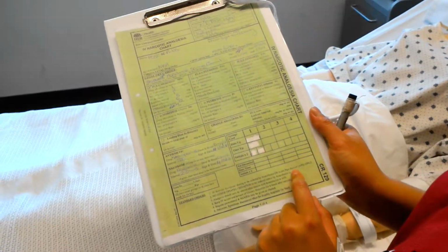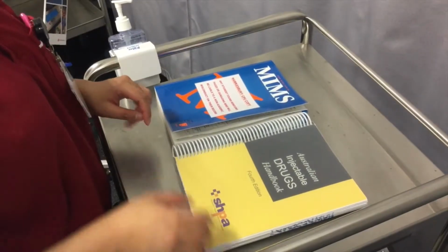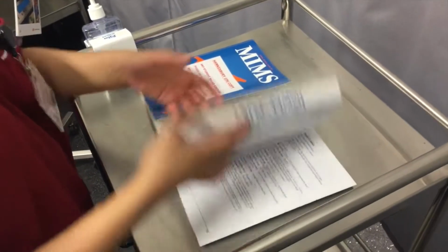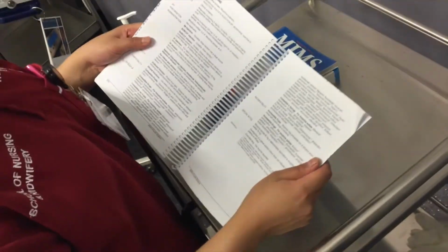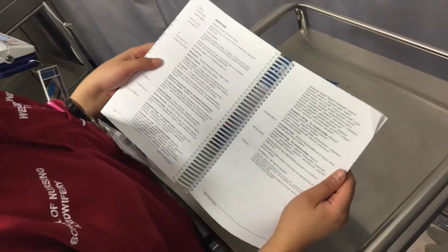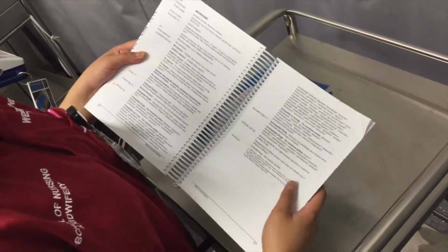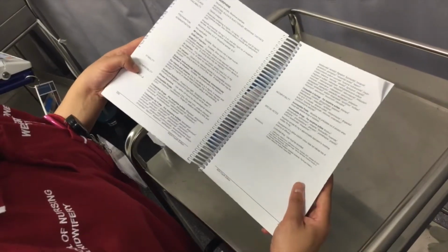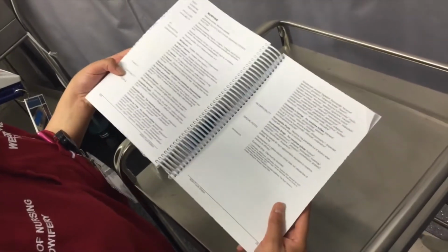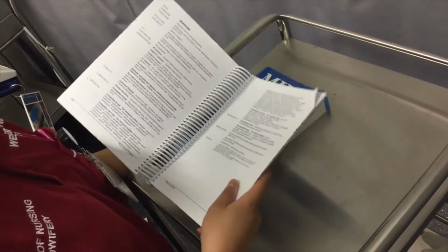Do you agree? I'm just gonna have a look at what morphine is on the drug injectable handbook. So from here it says that it is an opioid analgesic. I can give it through an IV, and it was ordered through an IV route, so I know that it's okay for me to do it that way. It's compatible also with sodium chloride, and I know that I need to mix it up with sodium chloride as well.